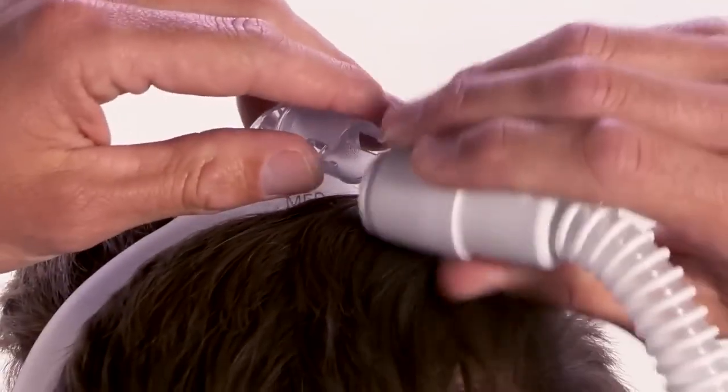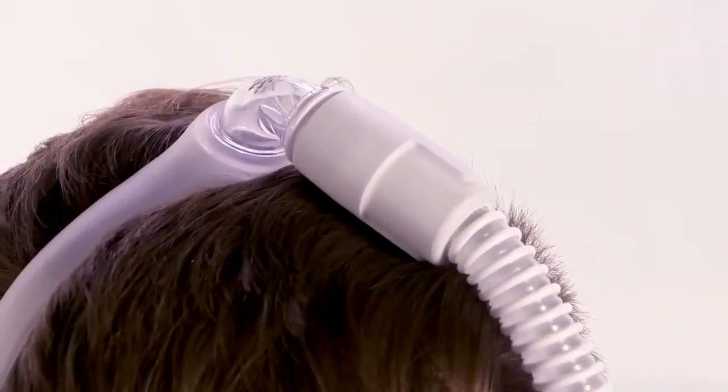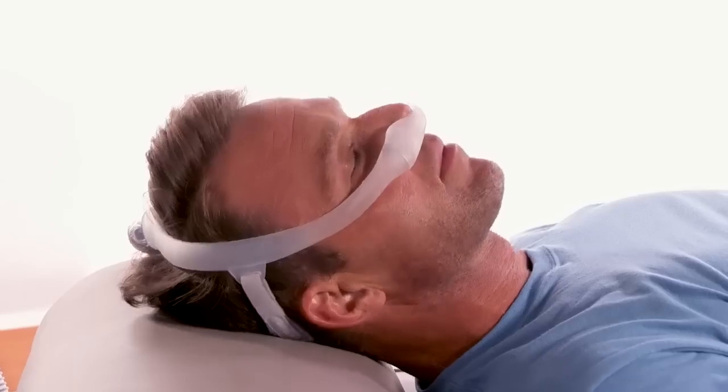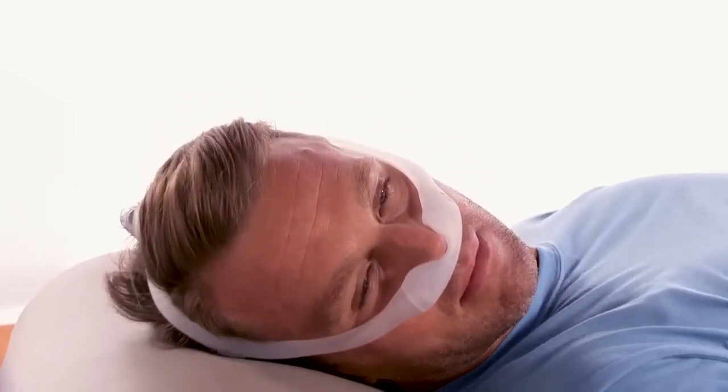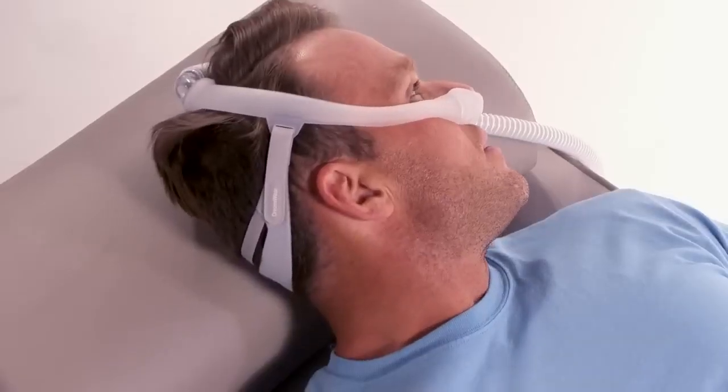Once the mask is in position, connect the quick-release with the attached tubing to the elbow. Turn the CPAP device on and lie down for final adjustments. Breathe normally through your nose and turn your head from side to side. Assume different positions in order to identify any leaks that may interfere with sleep.